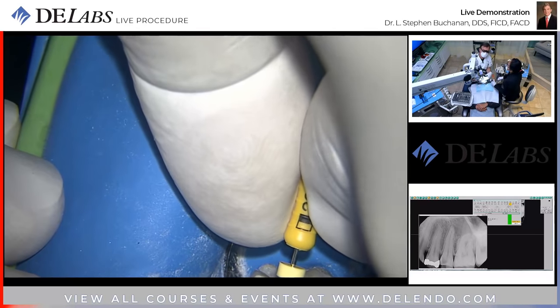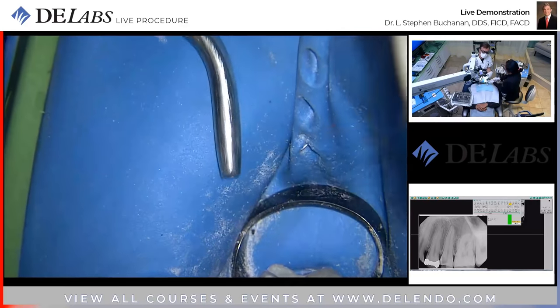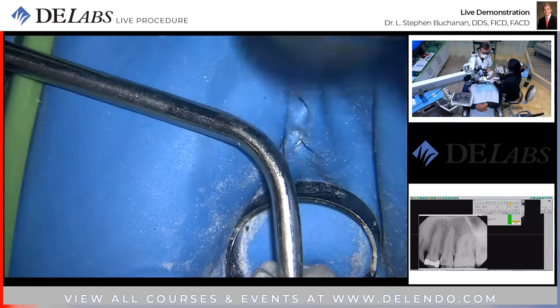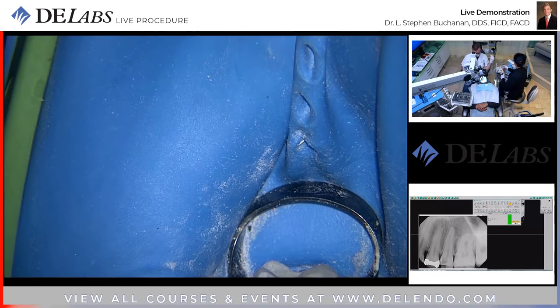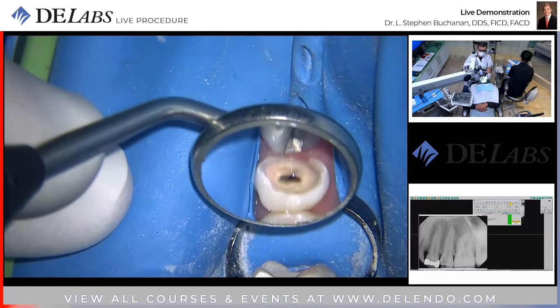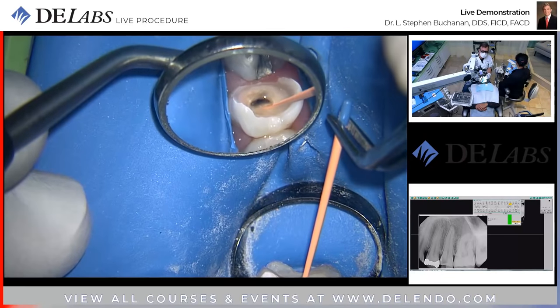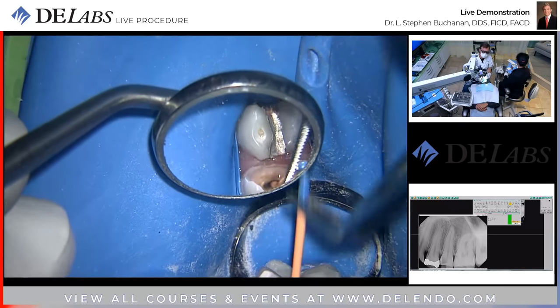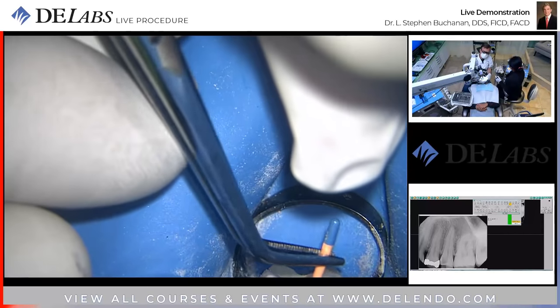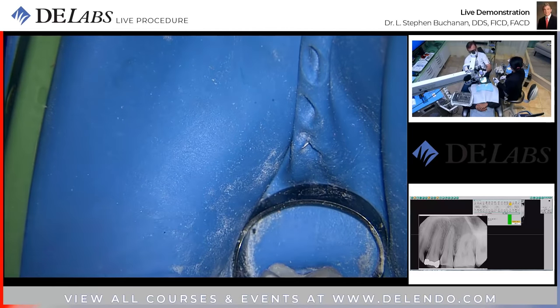And there's a little, just a little mini impediment right there. I think it's great because it's a large apical diameter. Okay, let's fit a 3004. Still don't think I need to cut a bigger shape down there. And the younger the patient, the less likely you need to cut shape, because now we can get it clean without cutting a bunch of dentin. Yay. Okay, here we go.